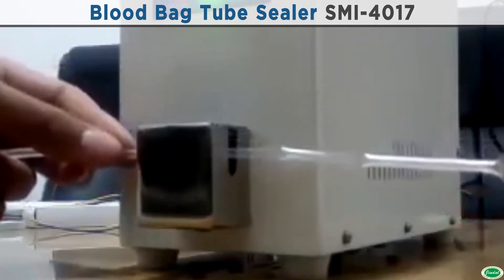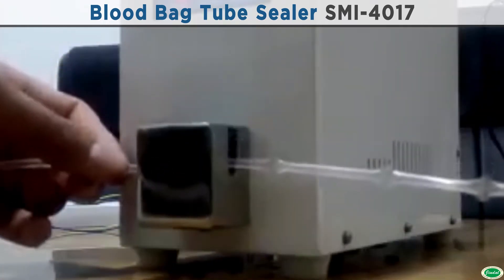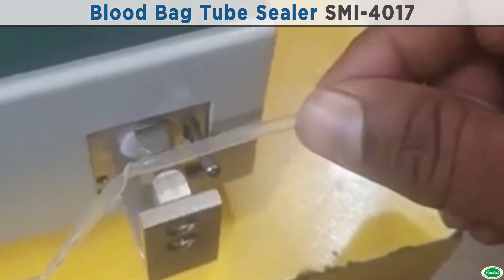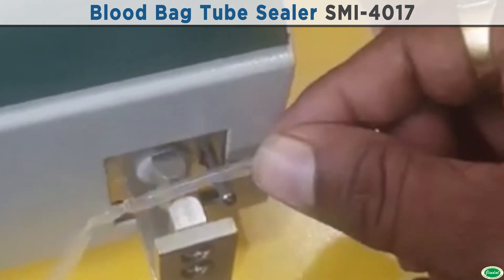Easy separation of tube once sealing is done. Sealing can be achieved in less than 1.5 seconds per tube by simple operation. The instrument is designed to operate on 220V single phase AC supply; a model with 110V is also available.